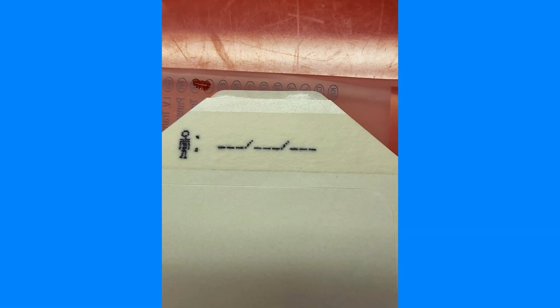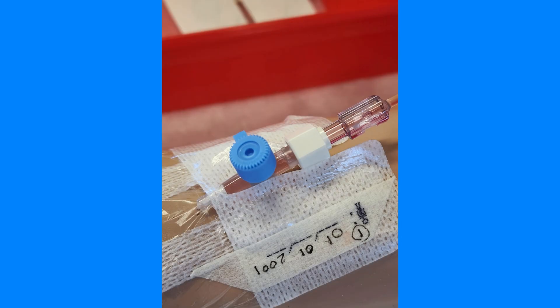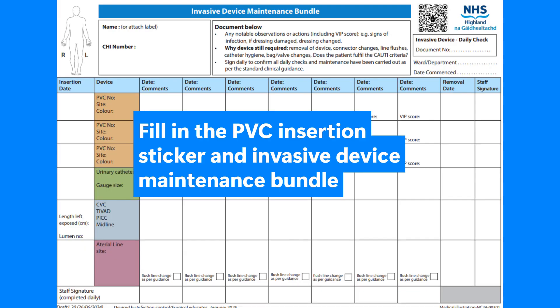Label the dressing with the date, time, and number of the cannula. Dispose of clinical waste appropriately and perform hand hygiene. Fill in the PVC insertion sticker and invasive device maintenance bundle.